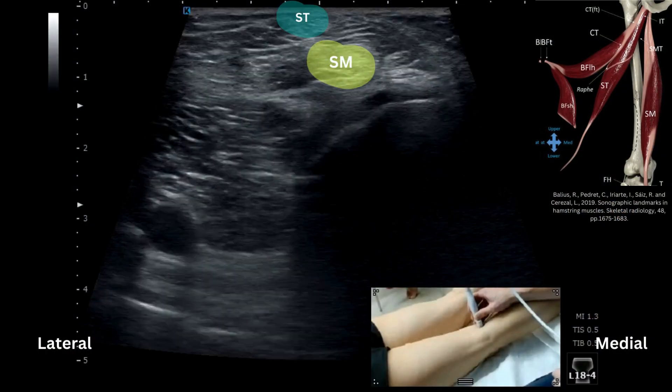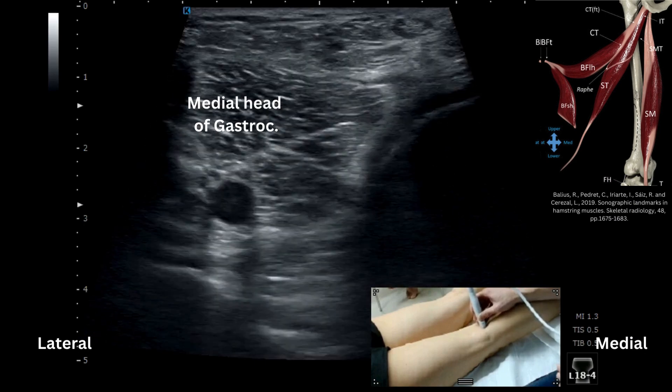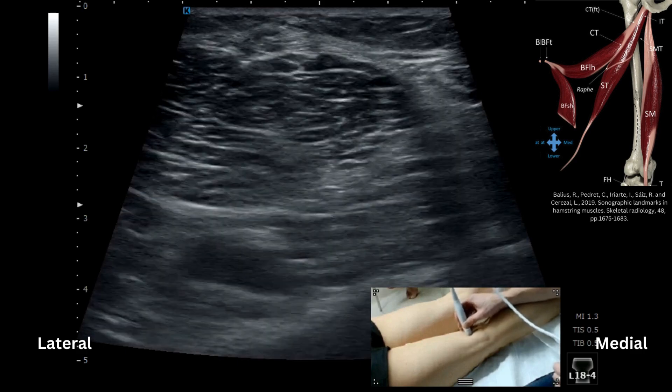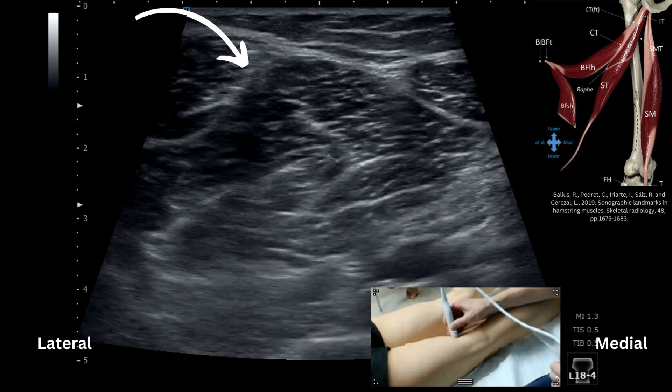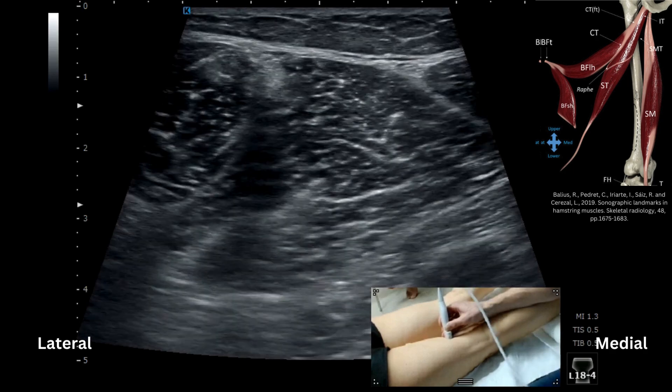In this position we have semimembranosus and semitendinosus on top of the femoral condyle, medial head of gastroc, and the popliteal artery. We're then going to come up the thigh where we start to see the semitendinosus expand, and I need to move my probe and toe it in slightly to come a bit more medial as I come around the edge.